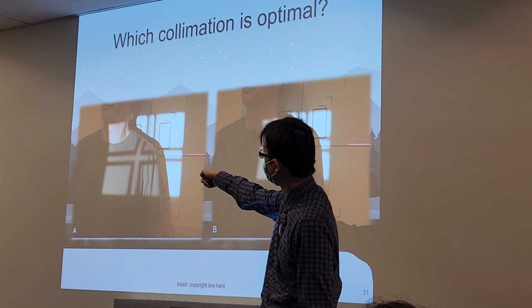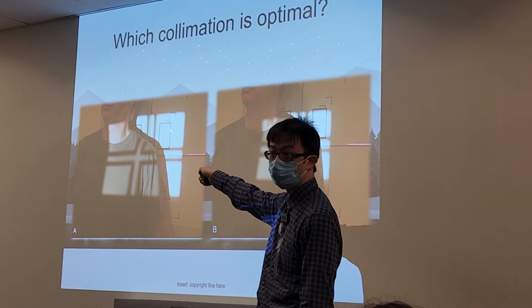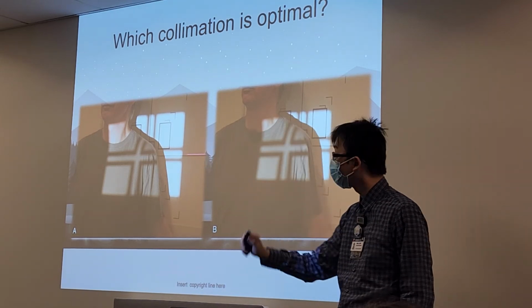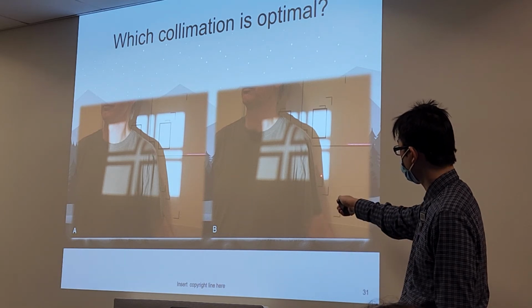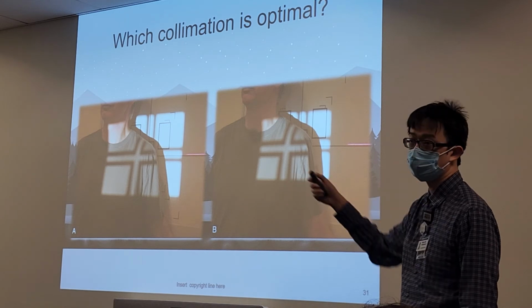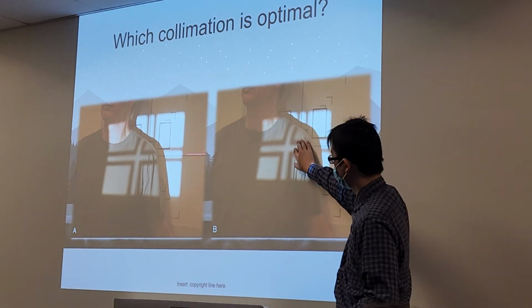If you look over here, you see all of this light on the backboard. All of this light exposing stuff would just knock the patient. Over here, we only have the minimal amount of light. More of our light is focused on the patient compared to here. We've coned in because we only care about this section.